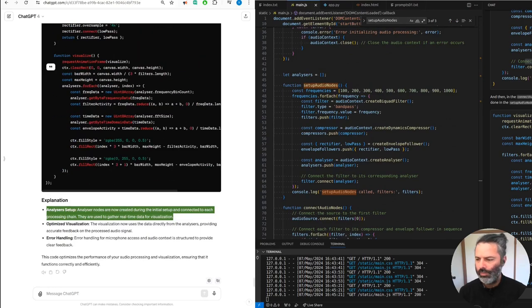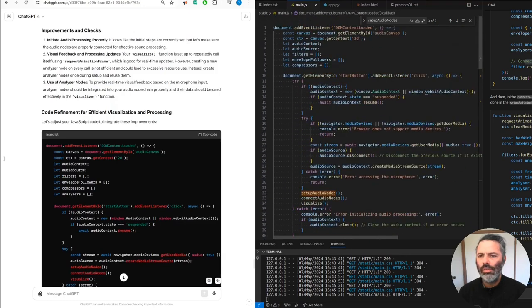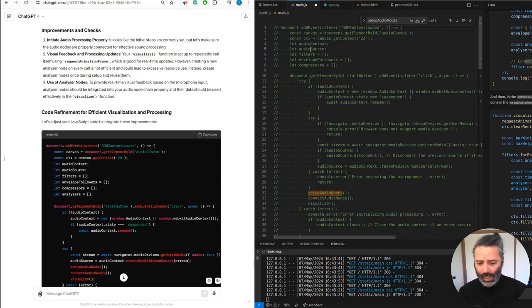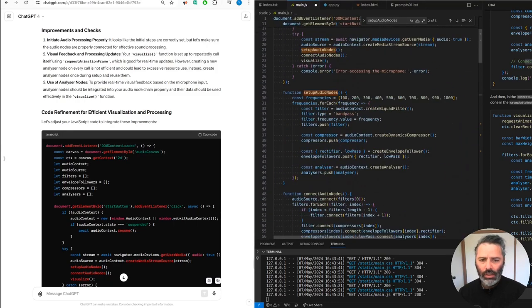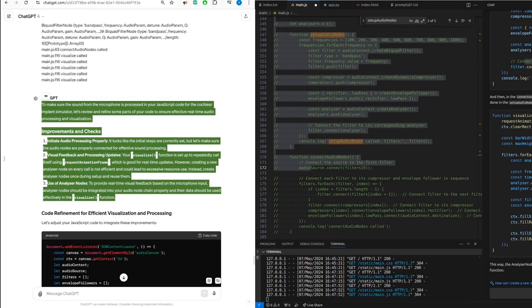Analyzer setup. Analyzer nodes are now created during the initial setup and connected to each processing chain. They're used to gather real-time data for visualization. There's obviously missing stuff. We can comment everything out so we have it at the bottom, the new code. Yeah, obviously that's incomplete. To make sure the sound from the microphone is processed in your JavaScript code for the Cochlear Implant Simulator, let's review and refine some parts of your code to ensure effective real-time audio processing and visualization.